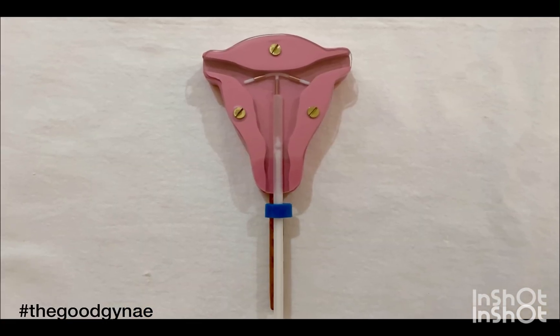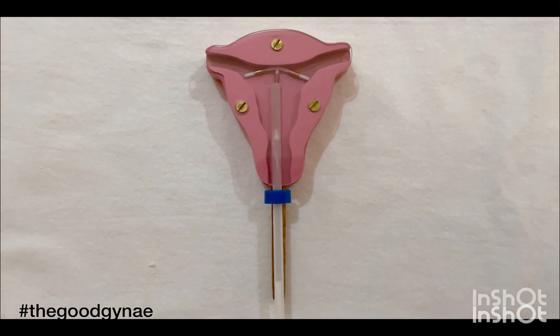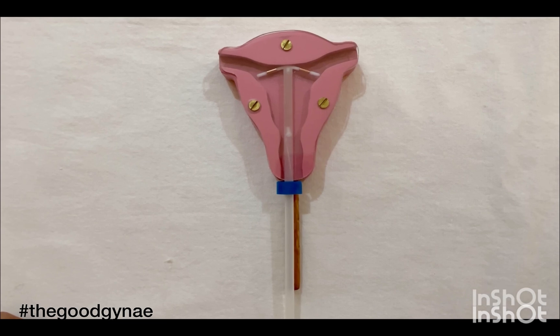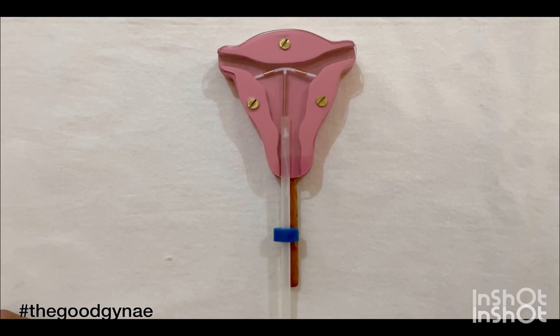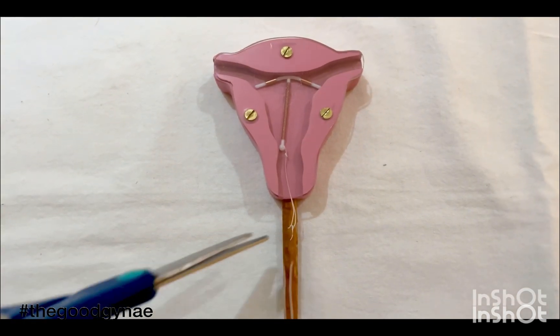The rod or plunger is then removed to avoid entanglement with the copper T threads. The insertion tube is pushed up gently until a slight resistance is felt, to ensure that the copper T is placed at the fundus. The tube is then withdrawn and the copper T threads are cut at two centimeters beyond the cervical os.